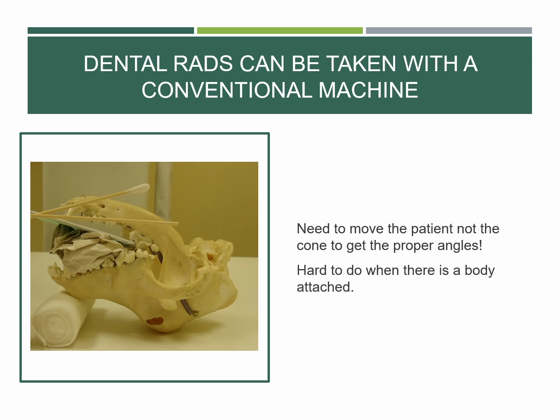Okay, so that's it for the intro. We will be looking at the two machines, the CR and DR systems in lab, and you're going to start playing with it, and you're going to tell me which one you like best. You're not allowed to tell me you don't like any of them, sadly, or maybe greatly, happily, if you like dental radiography. It's a very common thing that's in practice now.